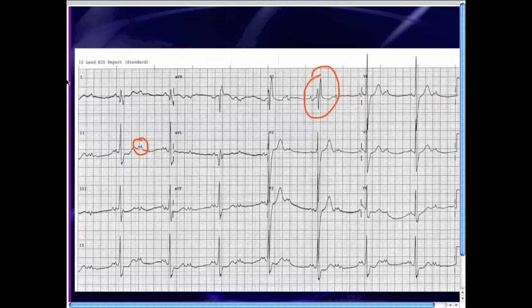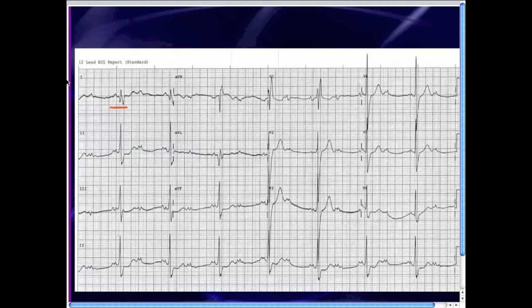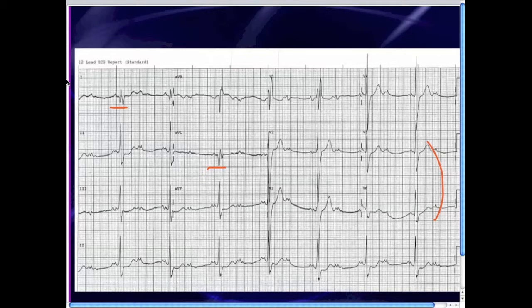There's also a right bundle branch block pattern. And there's a bit of a rightward axis in lead one because the patient has Q waves in lead one and also in AVL. Leads one and AVL are representative of the high lateral part of the left ventricle, so this patient has had a previous high lateral wall myocardial infarction. In V5 and V6 — the other lateral leads — there is no evidence of Q waves, so we say this is a high lateral old MI rather than a general lateral MI.